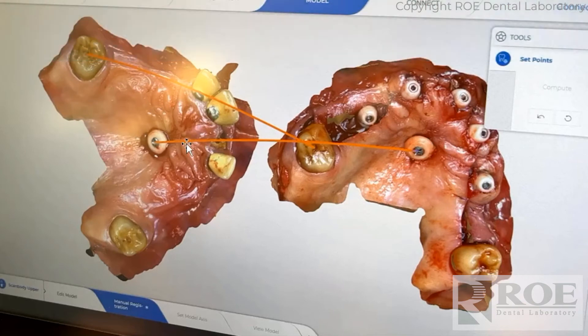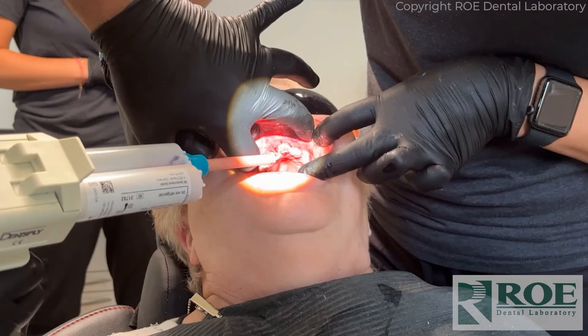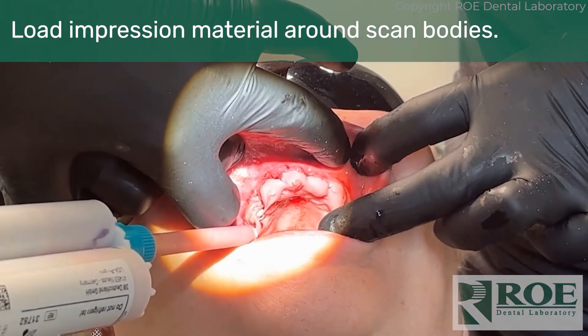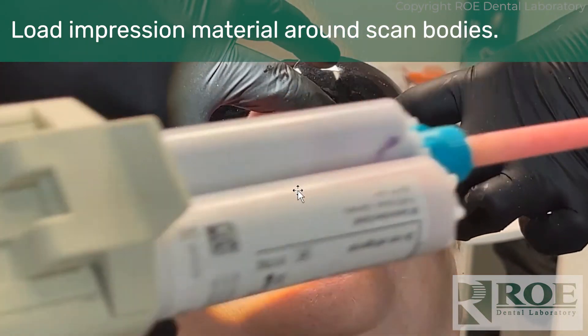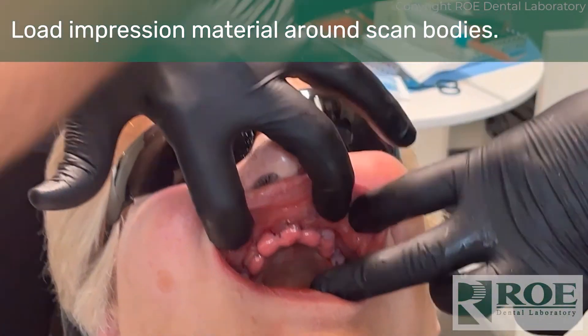The other process is to have a denture. We can design it, print it, and ship it along with the guide — or we can design it and the doctor prints it in office, as Dr. Sullivan did here. It doesn't have to be fancy; it just has to be accurate. The doctor will load impression material around the scan bodies — not the flags, but the scan bodies. They're screwed in and sutured, then the denture is delivered loaded with impression material.